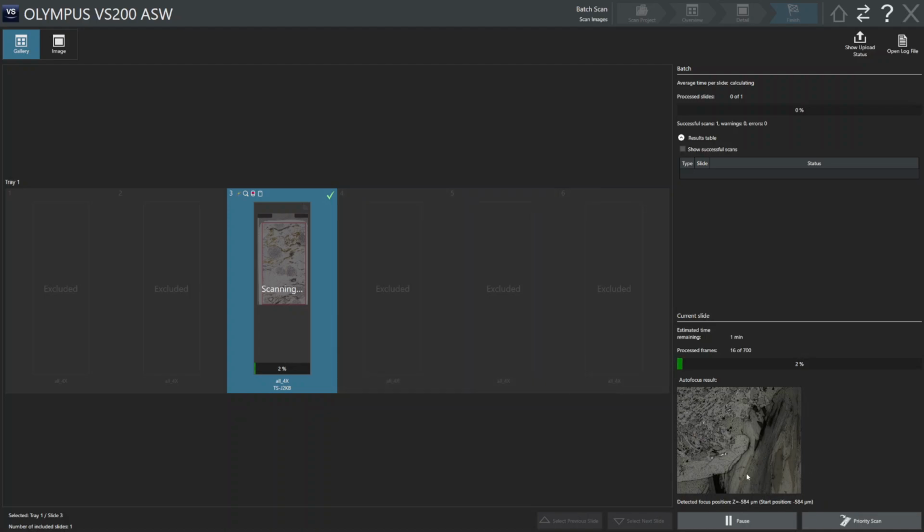The fields that are scanned at the beginning are for the focusing of the focusing plane. If this fails, you have to restart your sample settings from the beginning.